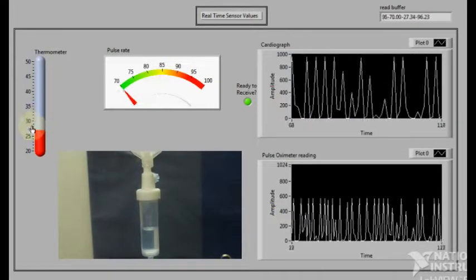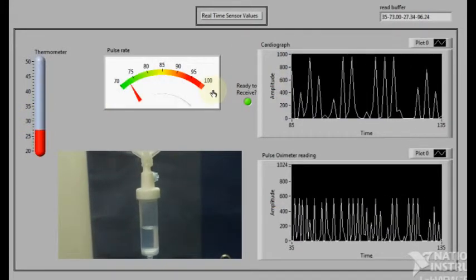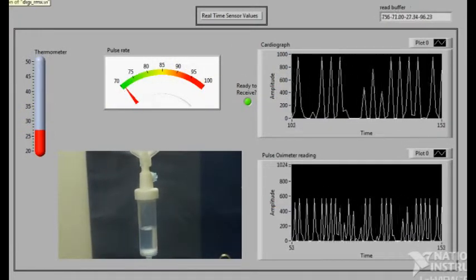The infusion set then precisely administers the anesthetic, and the rate remains the same as long as the parameters are within the threshold value.